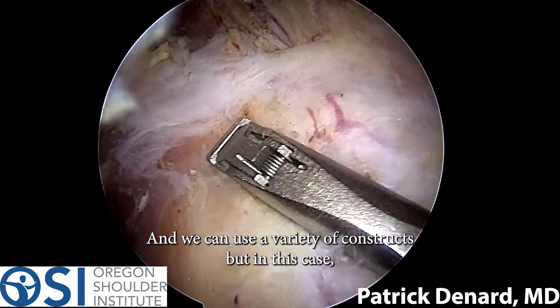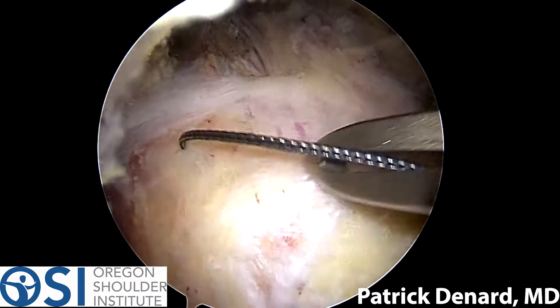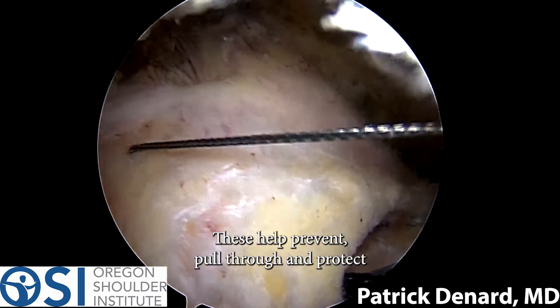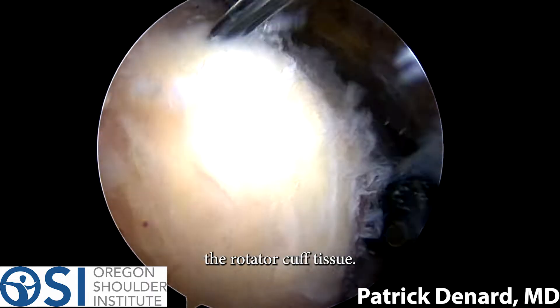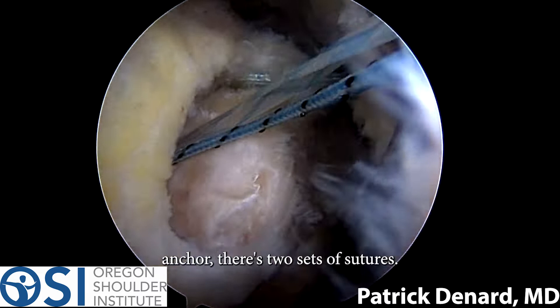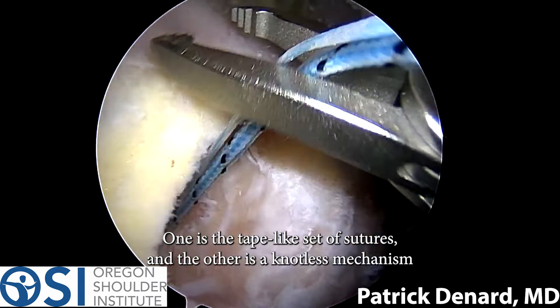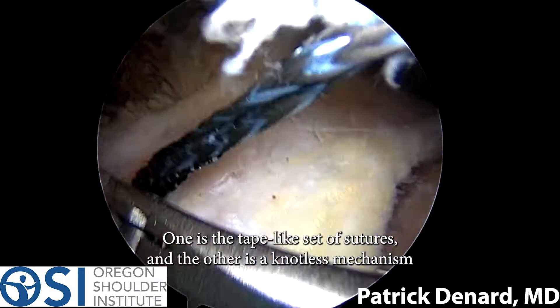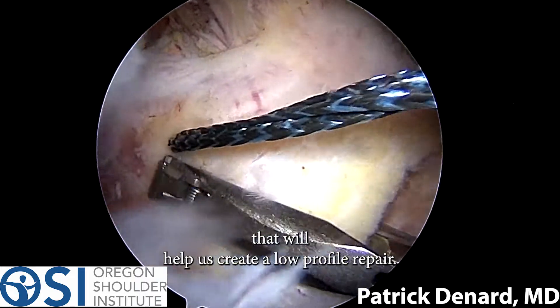We can use a variety of constructs, but in this case we have a set of suture tapes that are somewhat thicker. These help prevent pull-through and protect the rotator cuff tissue. With this particular anchor, there are two sets of sutures: one is the tape-like set of sutures, and the other is a knotless mechanism that will help us create a low-profile repair.